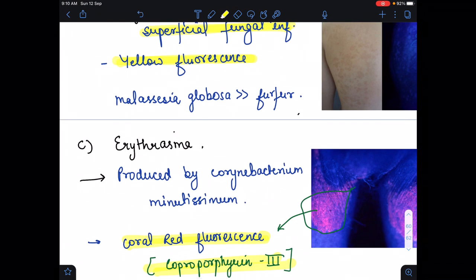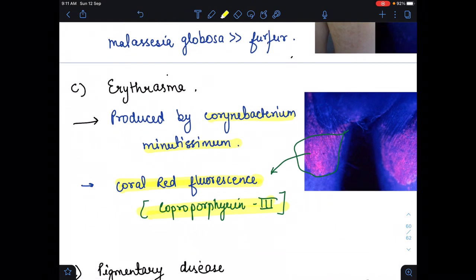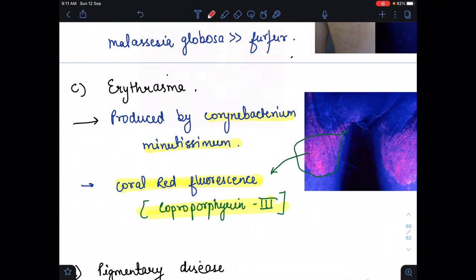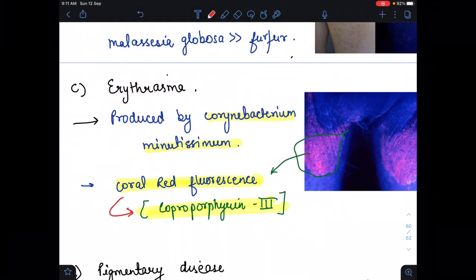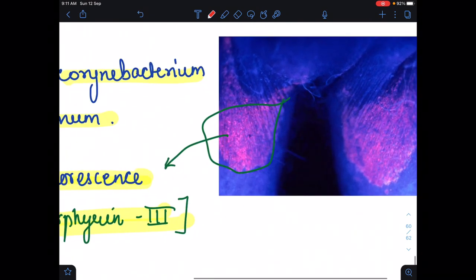The other infection is erythrasma, which is caused by Corynebacterium minutissimum. Under the Wood's lamp it shows coral red fluorescence. The reason it causes coral red fluorescence is due to coproporphyrin III. Here we see a coral red fluorescence — this is erythrasma.